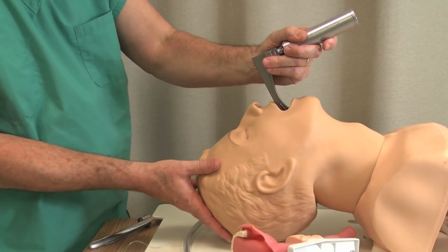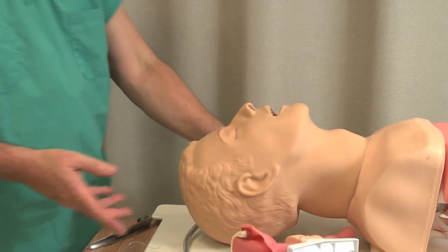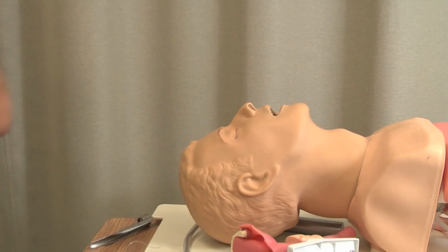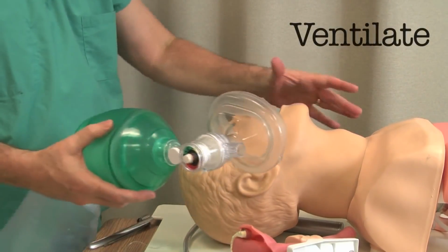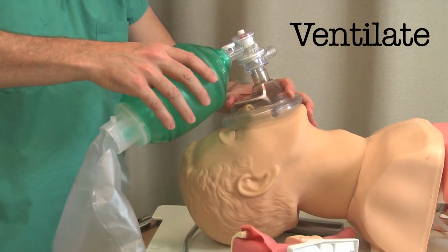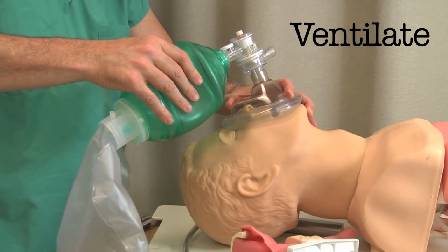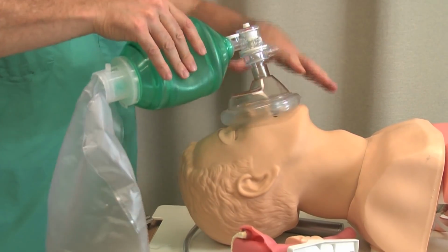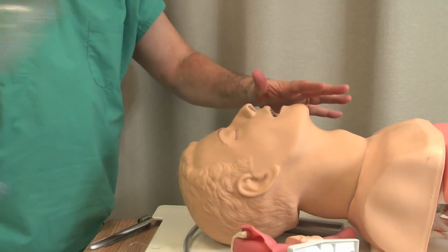What you want to do is, if things don't go right, first of all, buy yourself a little time. There's an old saying, you don't have to intubate, you only have to ventilate. Pull the laryngoscope out, give them some mask ventilation. Again, the importance of mask ventilation. There, now you've got the patient resaturated.